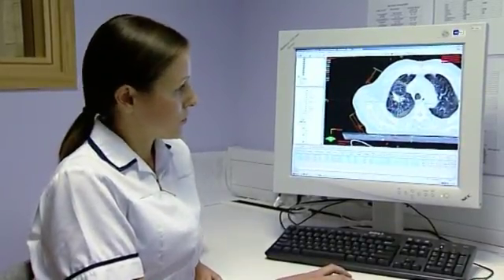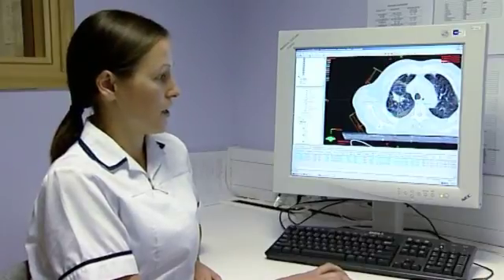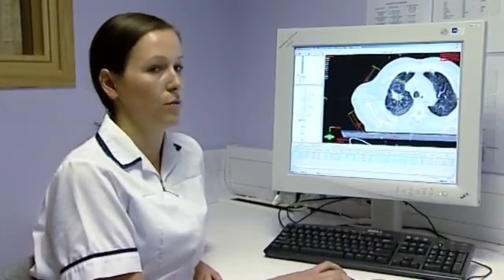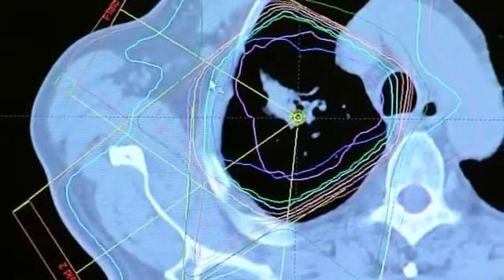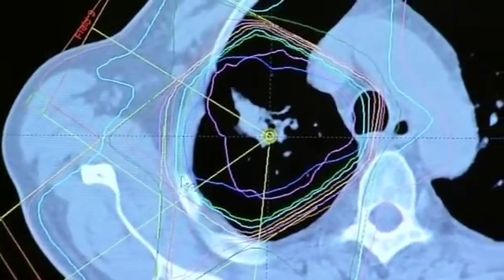There are generally two hotspots in a three field plan, i.e., where the three fields intersect, and these are this area here and this area here.